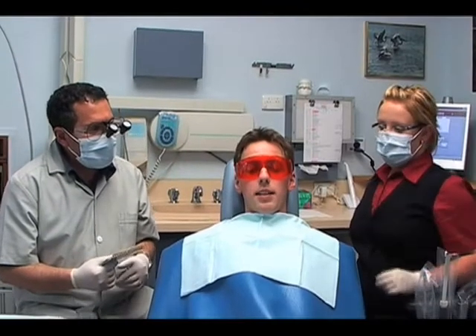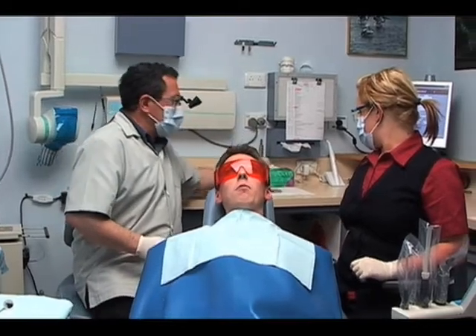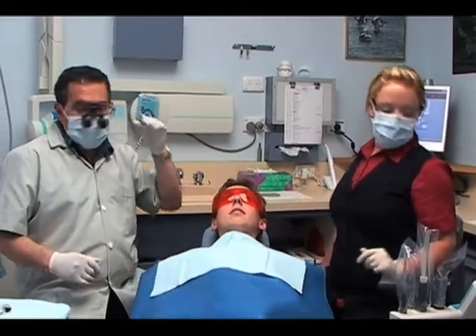If the patient has a history of sensitivity, you may want to prescribe a desensitiser such as SDI Soothe for half an hour prior to beginning the whitening procedure. Prior to starting the procedure, please ensure you, your staff and the patient are wearing appropriate protective eyewear, gloves and masks.